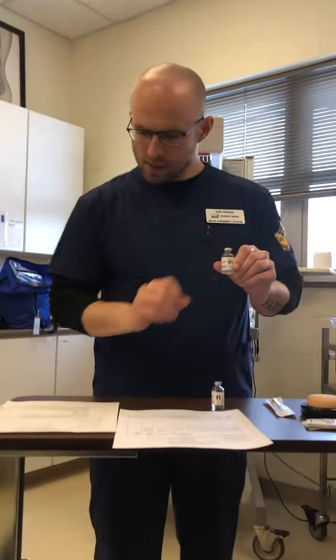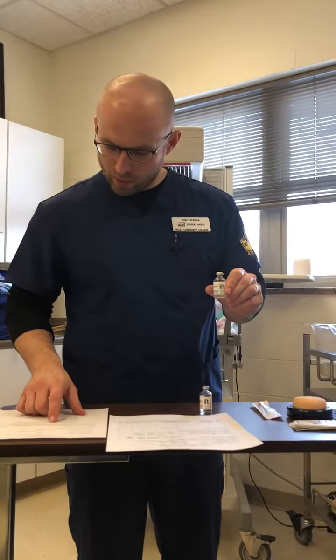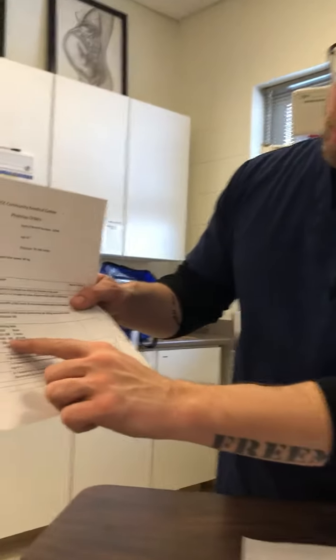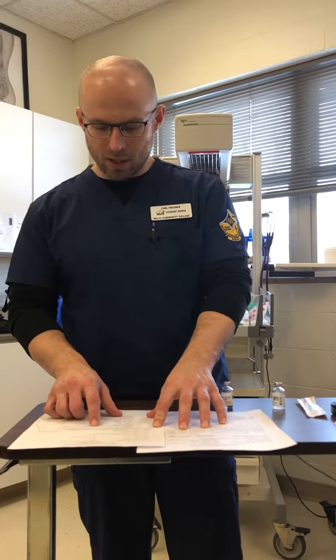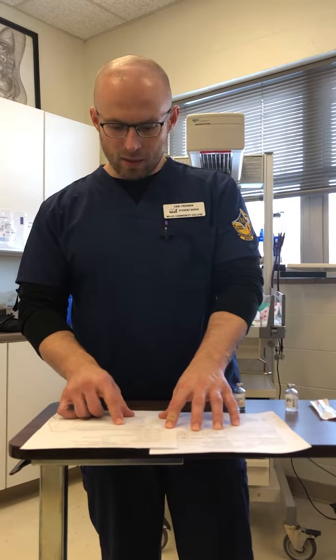We have our NPH insulin. The doctor has ordered 20 units of NPH, and the doctor has ordered a sliding scale regular insulin based off the patient's glucose. The patient's glucose at 0700 was 245. So based on the doctor's order, we will have 10 units. So just to verify, that's 20 units of NPH and 10 units of regular.